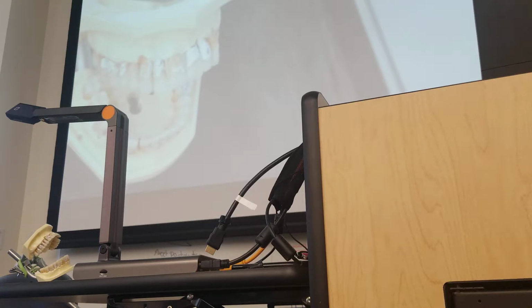So when you go from surfaces towards to away, if we're only using the outer edge, do we just skip the flip? No, you're going to do the same thing. Because in order to use the outer edge on surfaces towards you, you're sitting at 9 o'clock, and you switch to 12. Now this is the outer edge. Oh, okay, I get it now. So you still flip it, just like you did with the explorer. You'll have to do some telescoping for the premolar, right? Yeah, exactly.